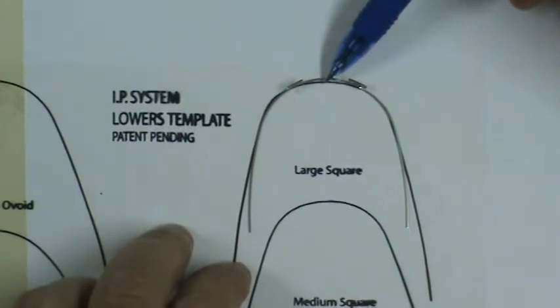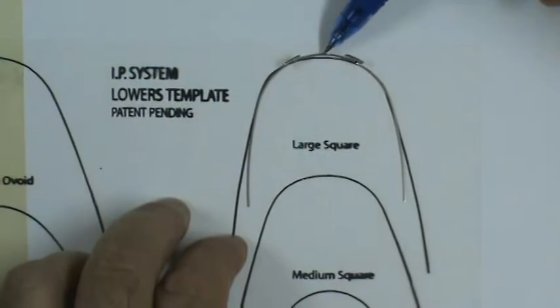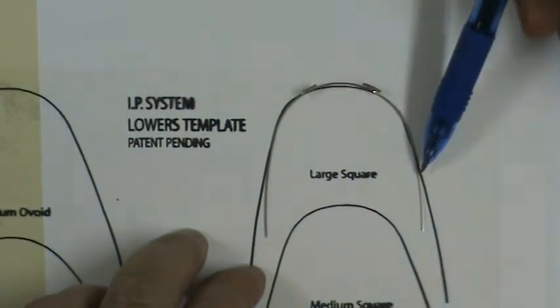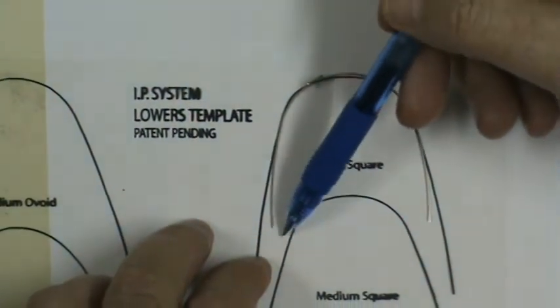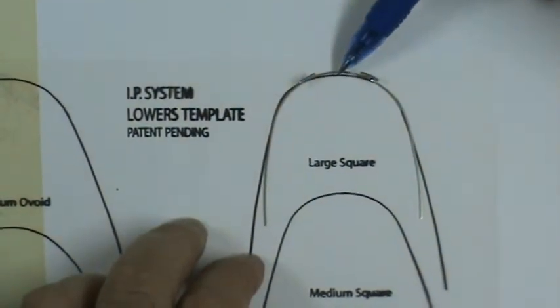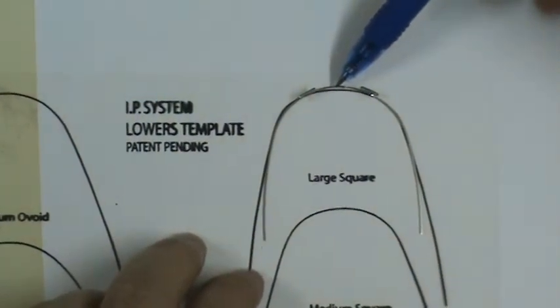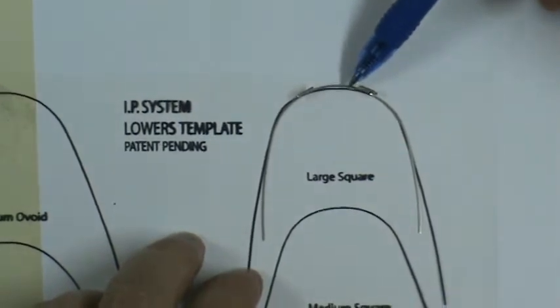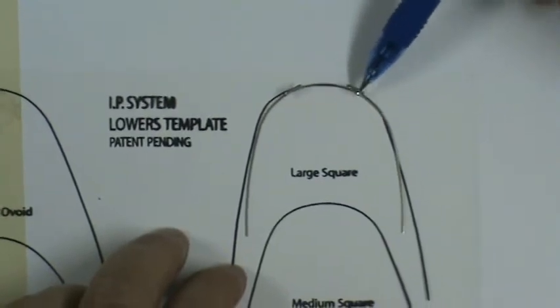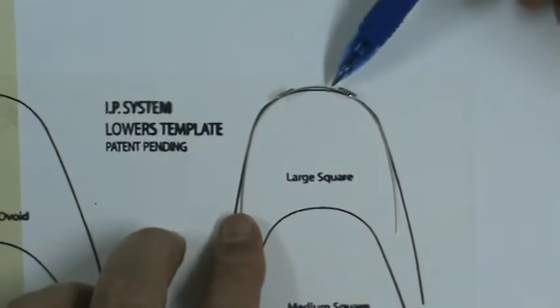And you start by laying the wire on top of the master, and you'll see that there is a bulge out in the anterior. And on the non-extraction number 1, we also have a curvature in on the molars, and we're going to have to straighten that out. So we're going to start out in the first step by flattening the anterior. That will be at the midline, and most likely just at the midline, but you might want to hit at 1/3 and 2/3 of the way in between the loop as a second and third bend to make it exactly the flatness that you want.